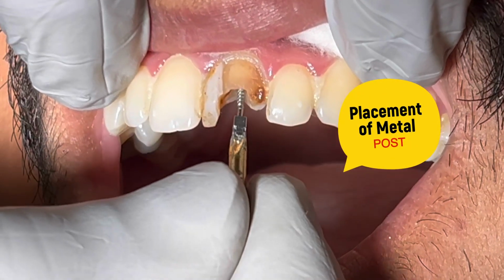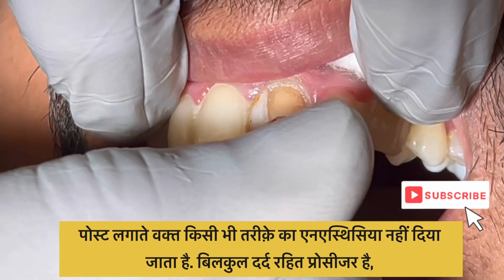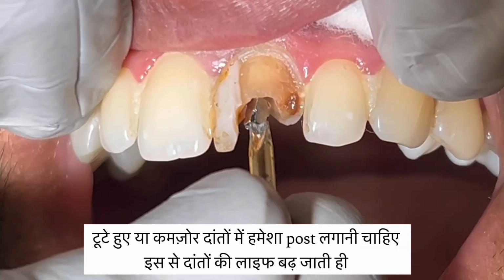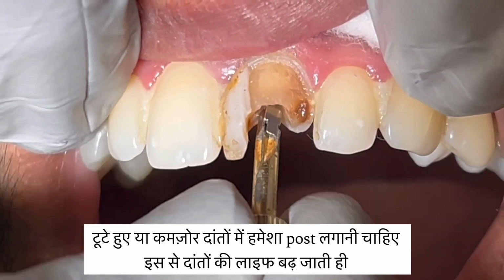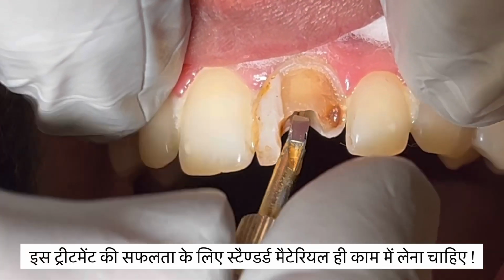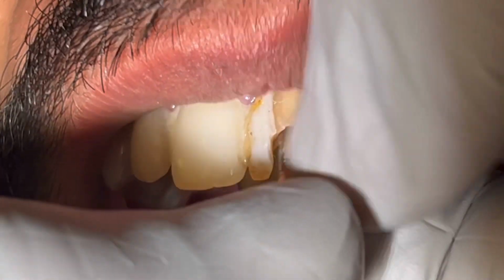First, the filling from the tooth that has undergone root canal treatment is removed and the canal is cleaned and shaped. Here a metal post is being placed. During the placement of the post, an injection for numbing the tooth is not given, and it's a completely painless procedure. The placement of the post increases the life of the tooth and makes it significantly stronger compared to before.